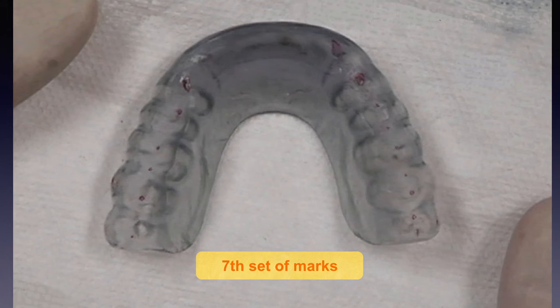The vertical has been maintained bilaterally at both vertical holding fulcrums throughout the entire process. The condyles have been rising relative to the fossa or the maxilla, either retrusively or surtrusively, and probably both. In this case, almost all surtrusively.